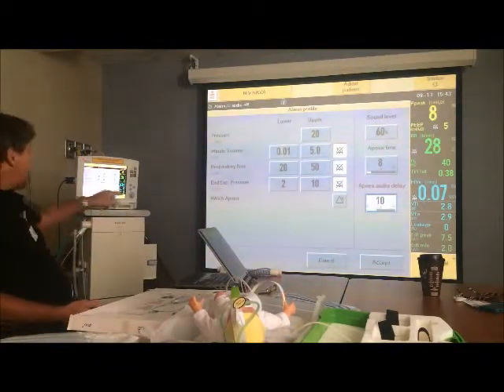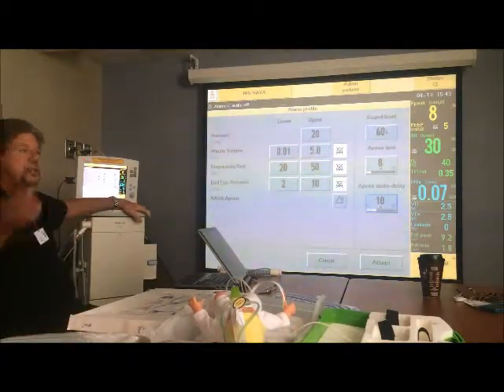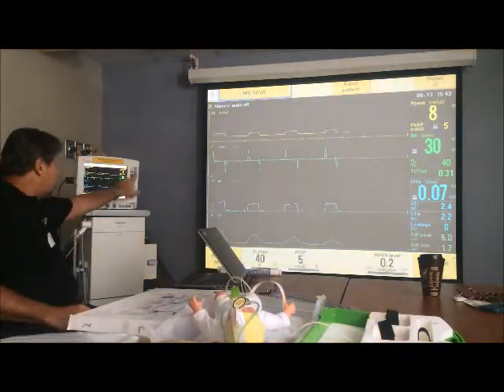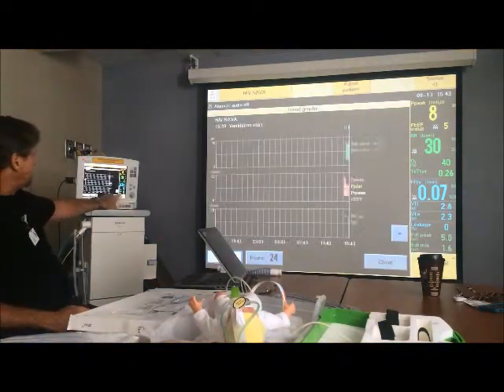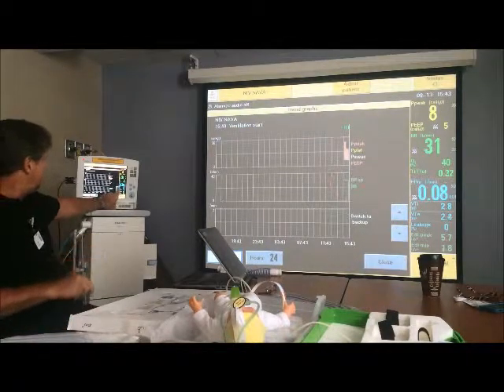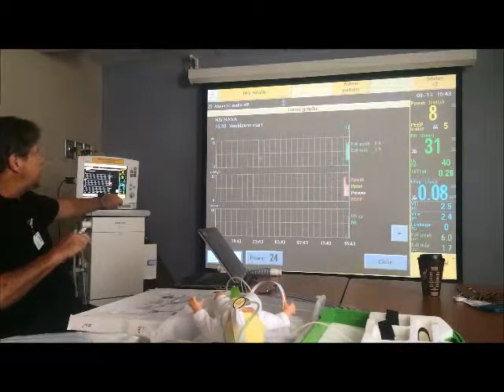Yeah, yeah. So now you go, well, I want to see how many switches to backup he's had. So what you can do is go to your trend screen and go down, and by the way, there's your EDI. So you can see what his EDI does over time.